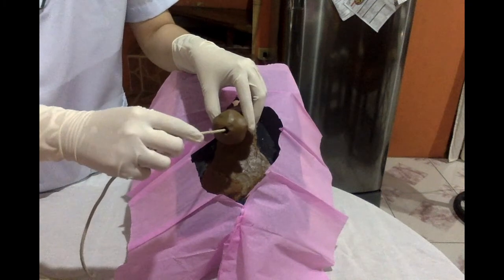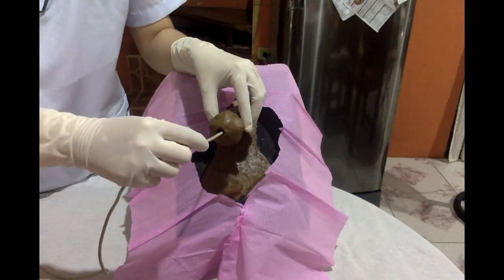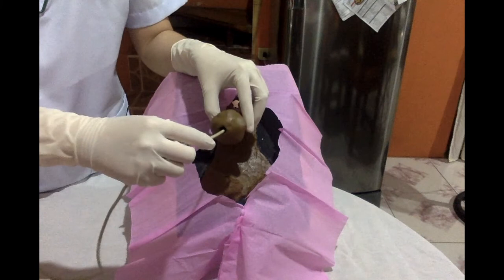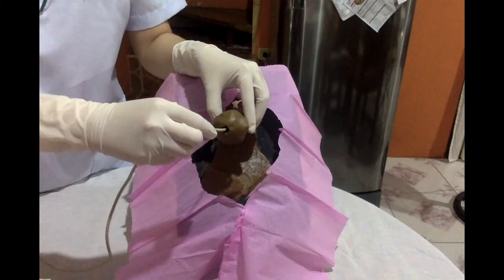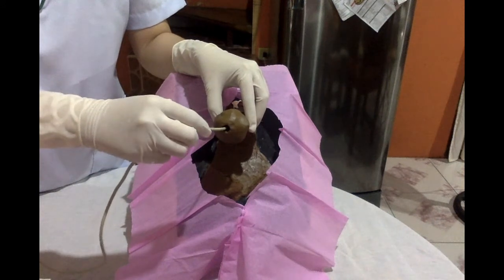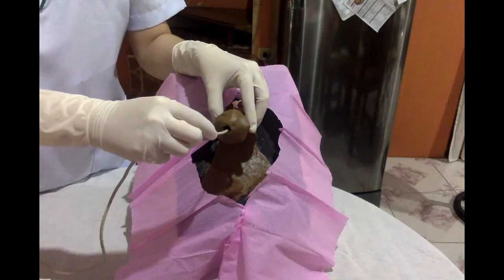Then I will advance an appropriate distance, around 1 to 1.5 inches, to ensure that the catheter is advanced far enough not to be dislodged and for safe inflation of the catheter retention balloon.